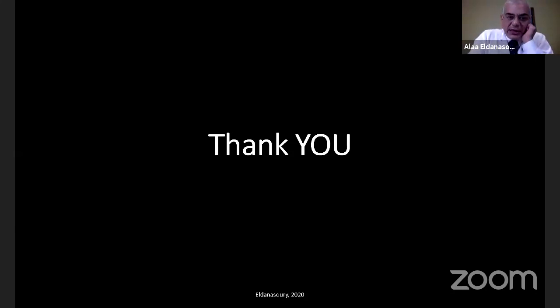Yeah, I totally agree. I remember those days when we started using the Orbscan many years back, when the Orbscan became available even before the Pentacam, and we started to rely on the posterior float, and we started to refuse many cases. But then we realized that was not correct, because that was a false positive. So with the OCT, I think we don't have the problem of false positives, and we have the ability to detect those very early cases and to understand what's happening, to understand why there are changes on the anterior surface, as in the case you showed in your presentation with the epithelial thickening, but the back surface is normal. So this is a normal case, but we understand why there are some changes on certain maps, because we have everything in one device. Absolutely.